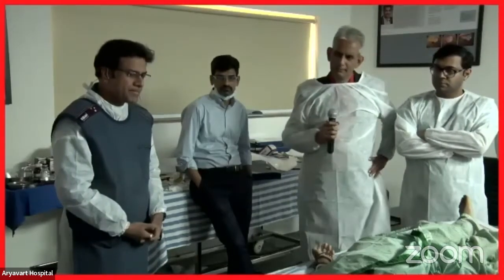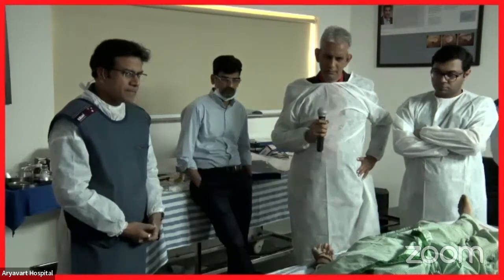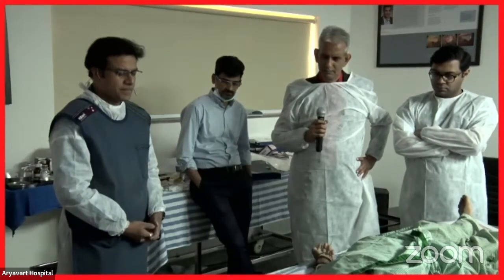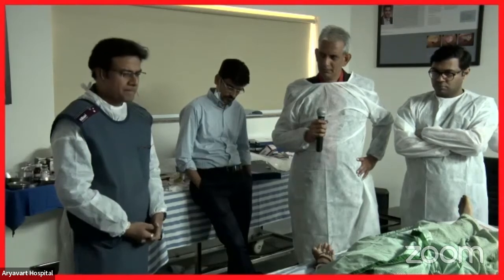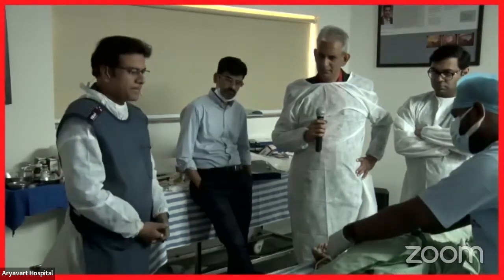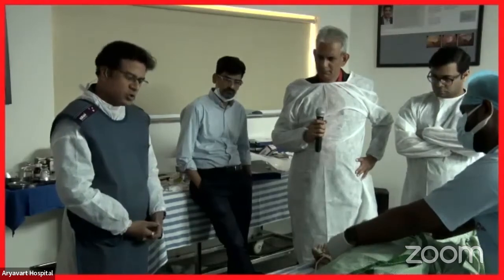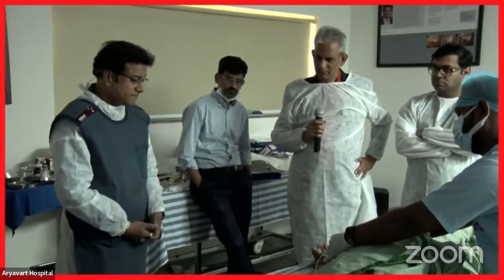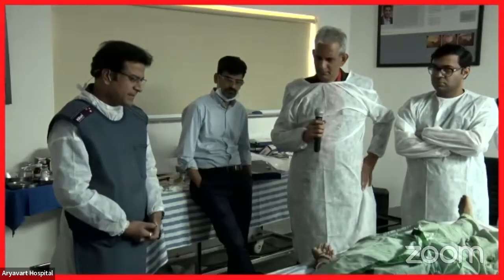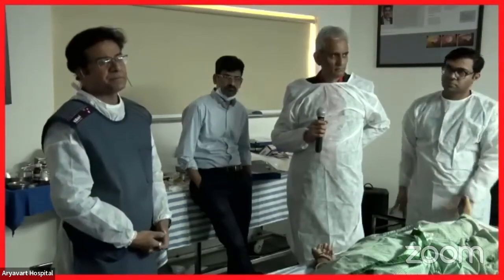Kavir, I have a few more views on how to identify and locate the jejunal loop. Can you please modify or correct me? One thing is that when you are seeing the liver, you can never see the jejunal loop. True, the left lobe of the liver. So if you go in the opposite direction, that is when you are more likely to see it. Am I correct? Yes, you are correct.